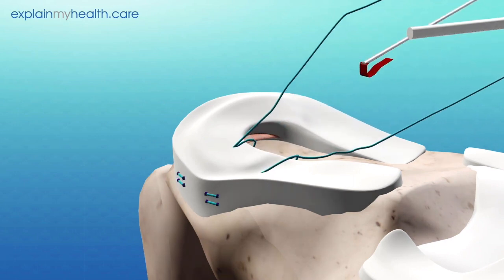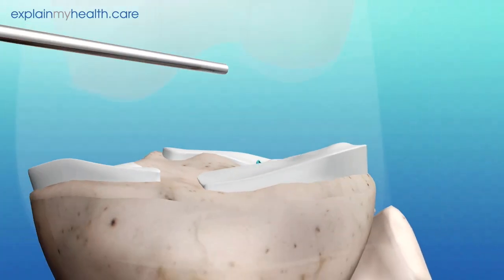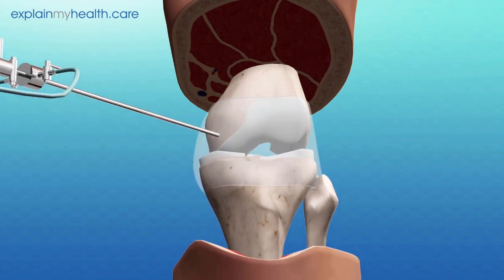Before tightening the stitches, the blood clots are inserted between the layers of the cartilage to encourage them to repair using cells from your own blood. The stitches are then tightened. The fluid is drained at the end of the procedure. The cuts are then closed with stitches.